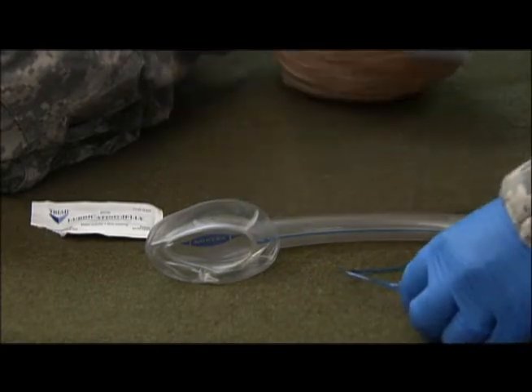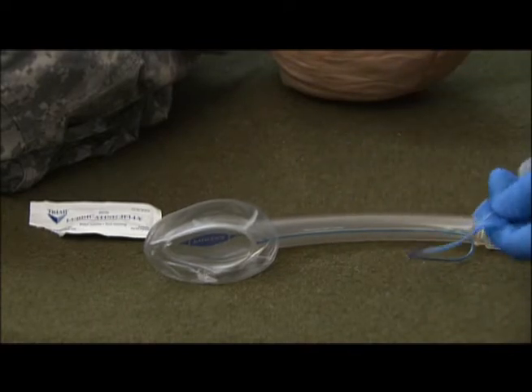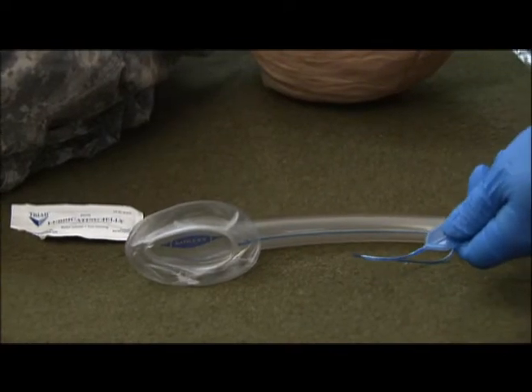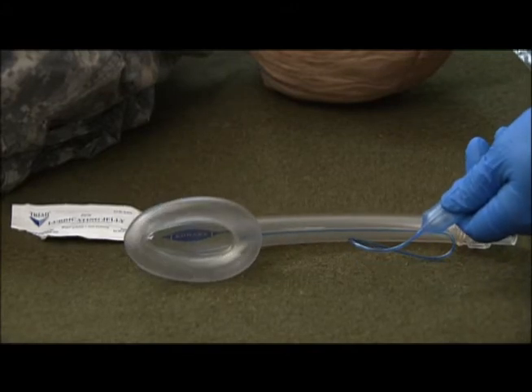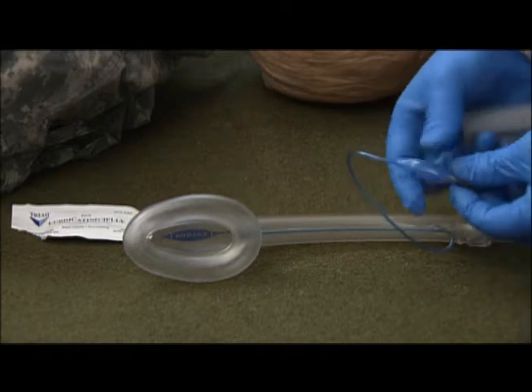I want to test my equipment. Taking a syringe and an LMA with approximately 35 cc's of air for this particular LMA, we want to inflate the bag and check for any leaks.